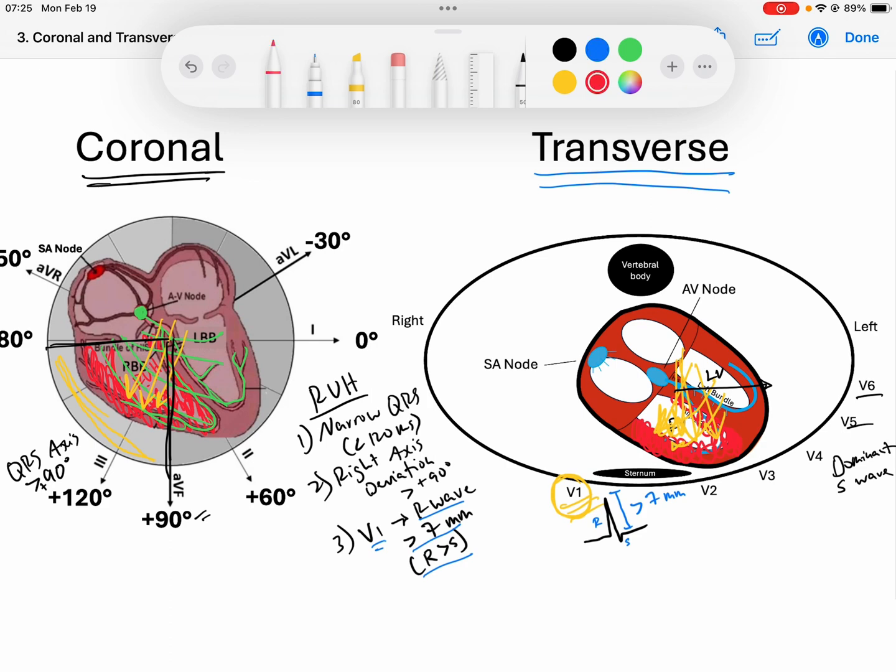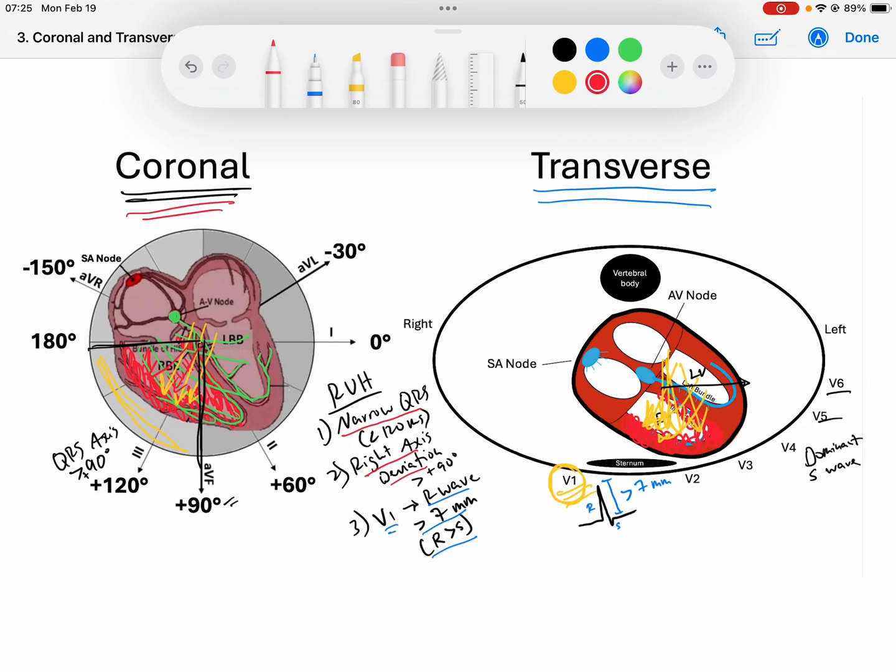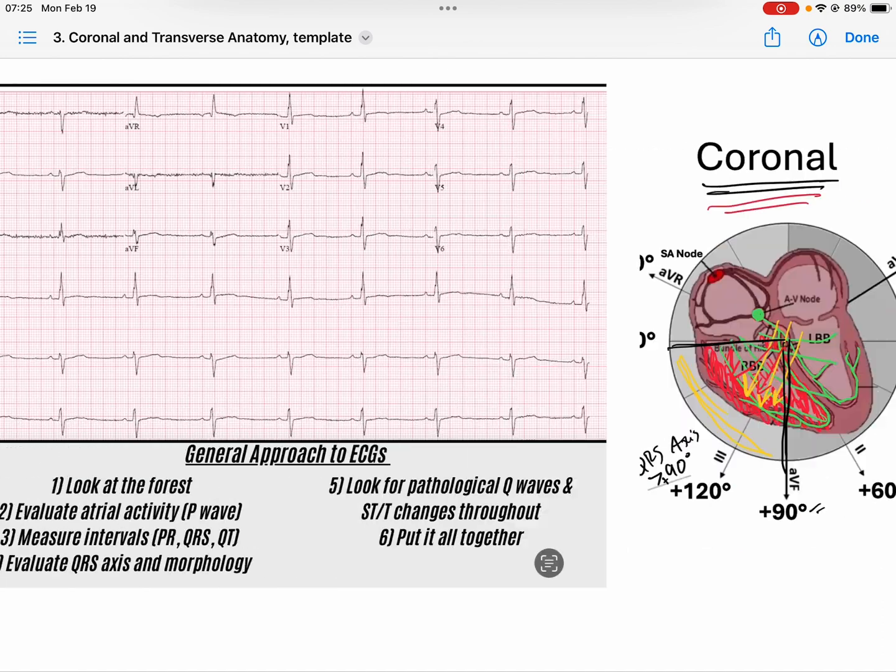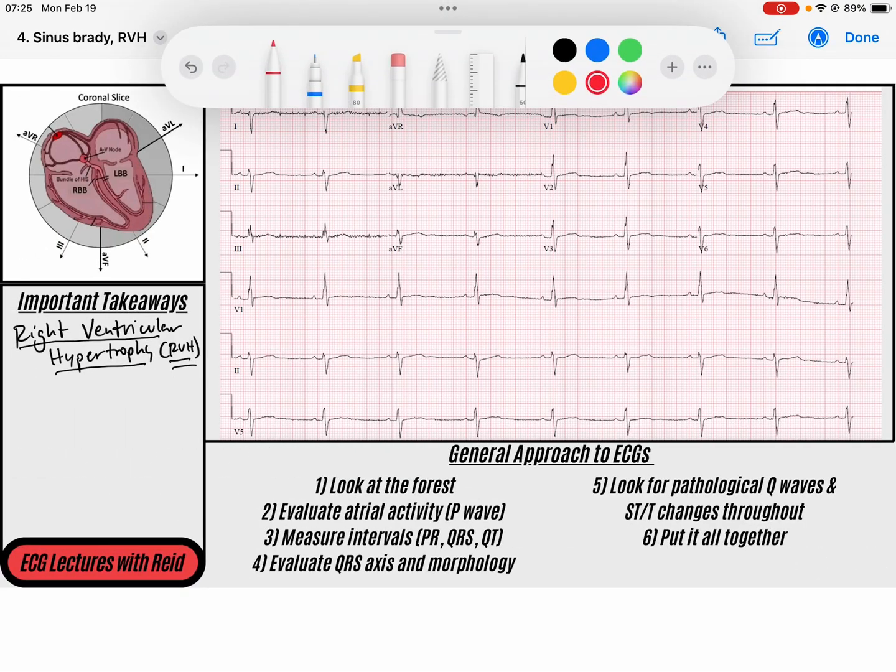Remember that we must have a narrow QRS complex because our His-Purkinje system, the highway system that conducts our QRS, is still functioning. We should have a narrow QRS that's less than 120 milliseconds, and we should have right axis deviation on our limb leads because our signal is favoring the right ventricle.